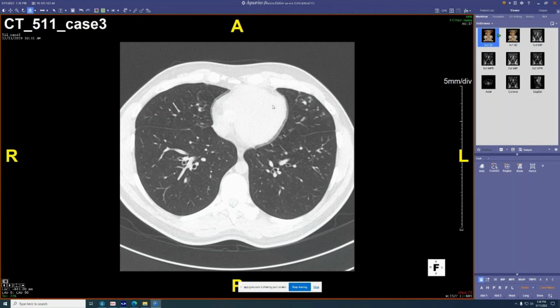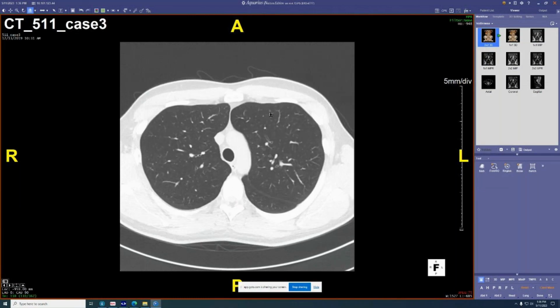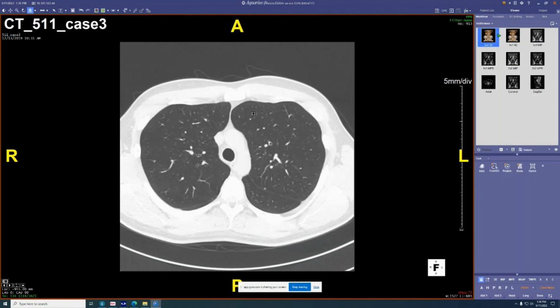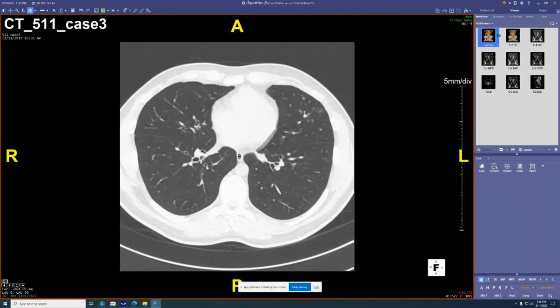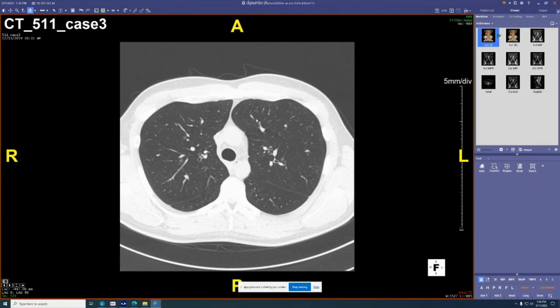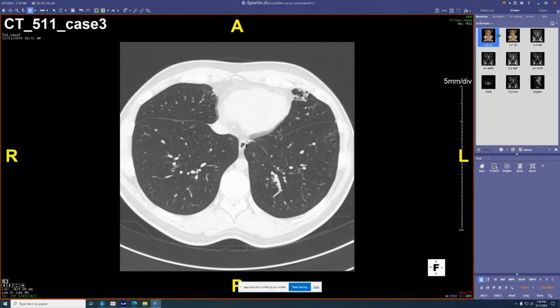David Lynch has a list of cases that are just by MRN, and I've been looking through them slowly. And the history I saw was tracheobronchopathy osteochondroplastica with silicosis from fabrication. I didn't look at the history, but they did biopsy. When they did the lung biopsy to prove the silicosis, they did biopsy the trachea on the way down for the bronch biopsy. But I don't know anything else about whether it's granite or marble.